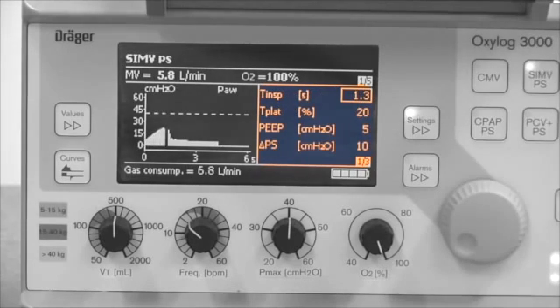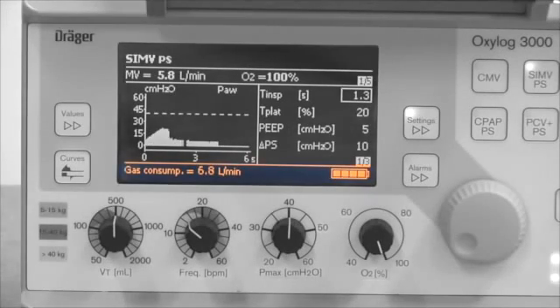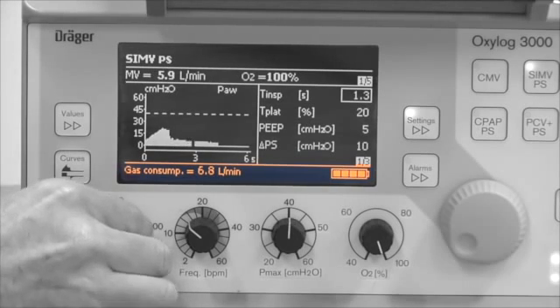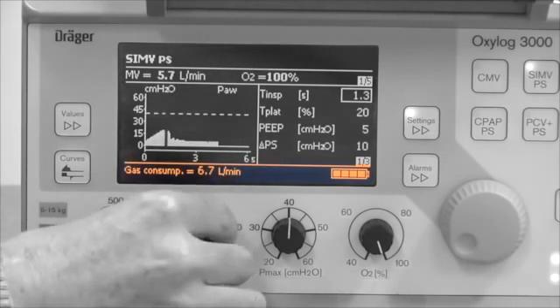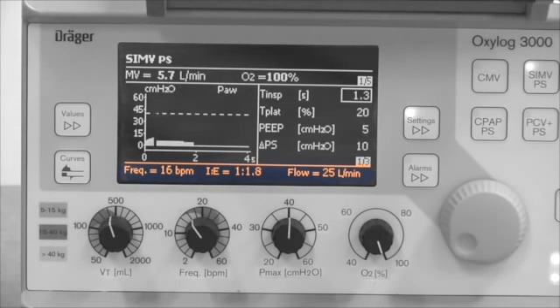Settings and alarm limits can be set by using the rotary knob controls. Finally, the information window is at the bottom of the screen. By default this contains information on oxygen consumption and battery supply. However, when parameters are changed using the rotary controls, the information window displays their numerical value as well as the value of derived parameters like the I:E ratio. It reverts to oxygen consumption and battery power a few seconds after ventilation parameters have been changed.